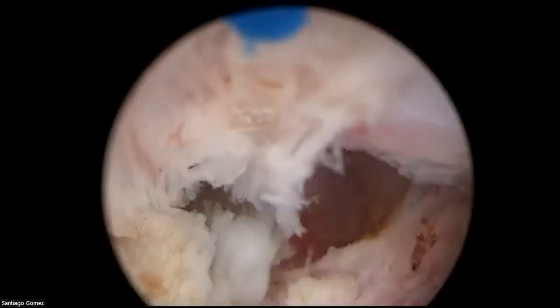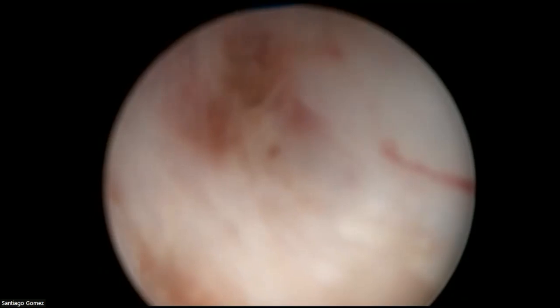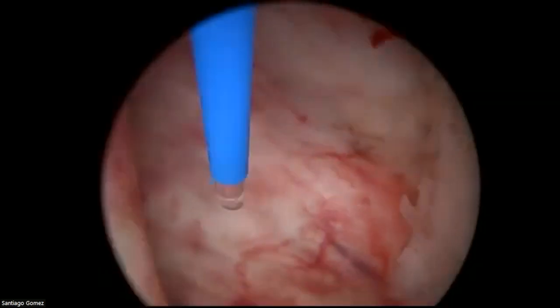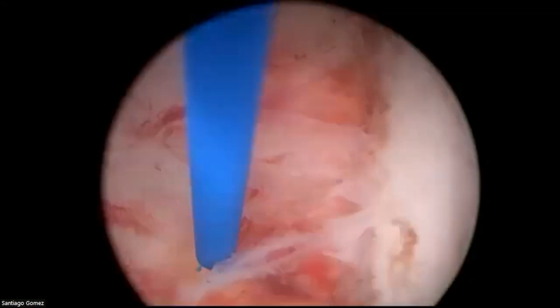But let's see now, because I think the prostate is very mobile here. I'm going to try to lift it a little bit and see if I can push it into the bladder carefully. Yeah. So you see, this side has rotated. I don't know if you can see that. This is prostatic urethra, and this is bladder neck. So now half of the prostate is inside the bladder.